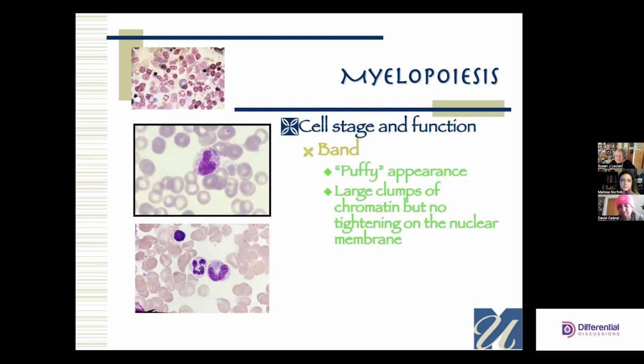It's just the way the cell has rolled across, and as it settled, it pulled a couple of pieces of DNA off to the side. So it's not really euchromatin. It's really just spaces that can occur.